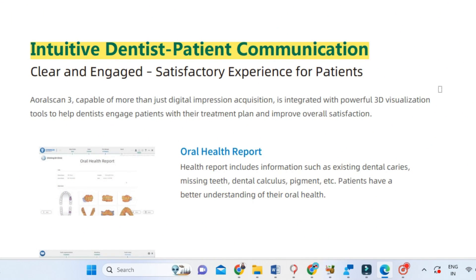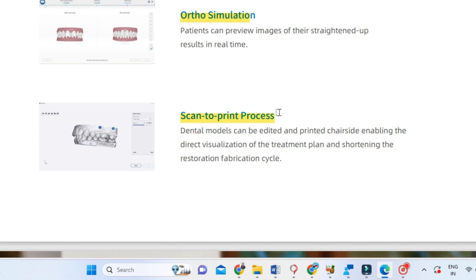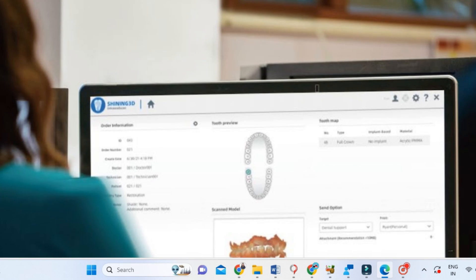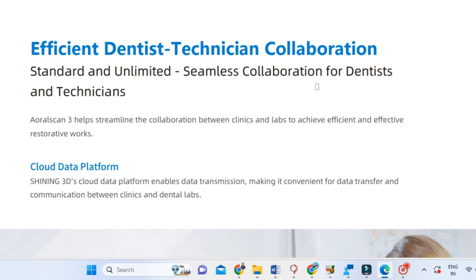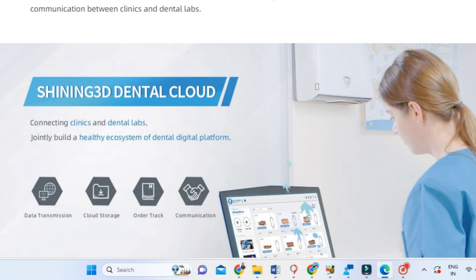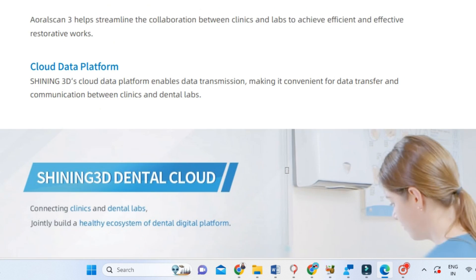Let me briefly tell you what's possible with this intraoral scanner. We can give an oral health report to every patient, do auto simulation, and scan and print models immediately if we have a 3D printer in the office. It is also an efficient tool for communication between the dentist and technician, and between the dentist and patient.